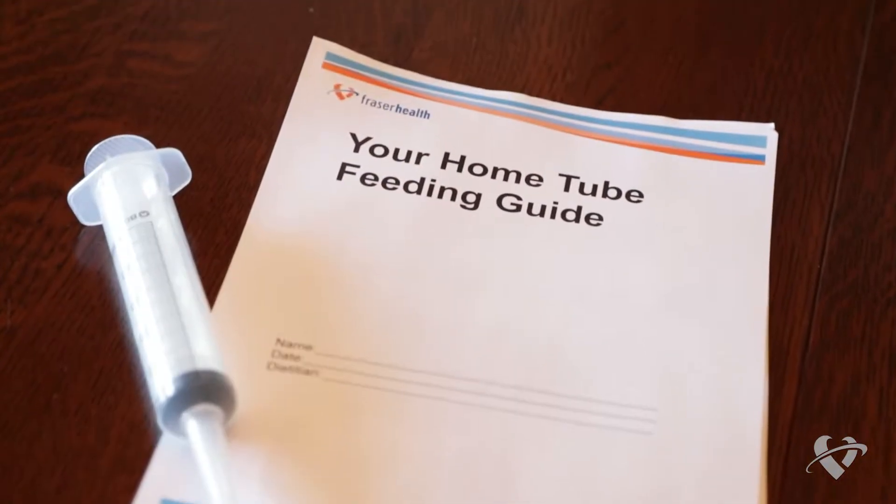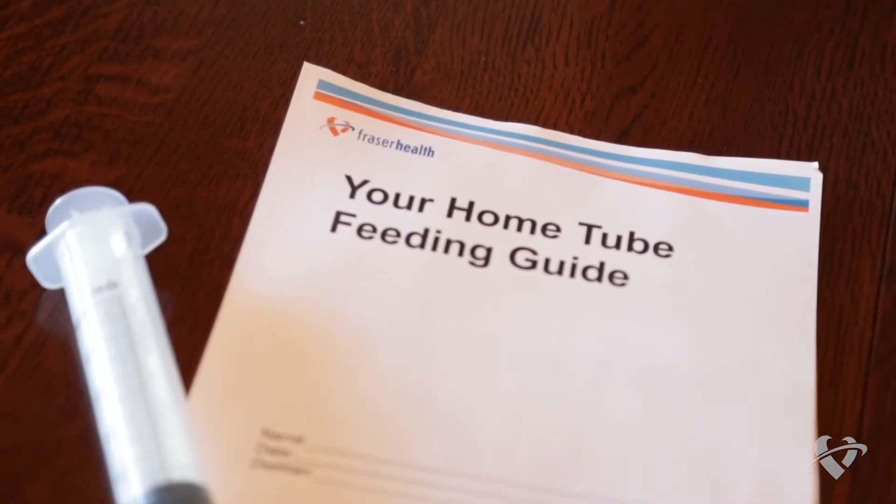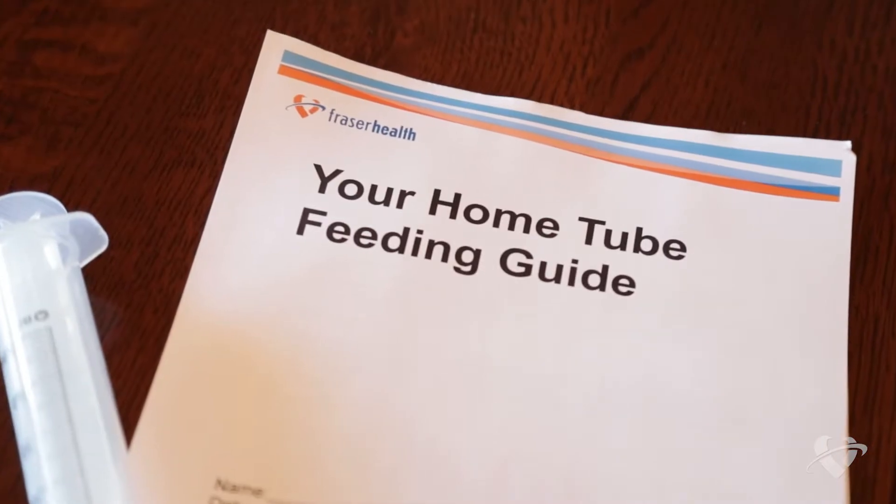Hello, my name is Anya and I'm a registered dietitian with Fraser Health in British Columbia. Today we'll be talking about tube feeding at home. In this video we will walk you through the steps to feed yourself using the gravity method. Please refer to the booklet provided by your dietitian that includes information specific to you.